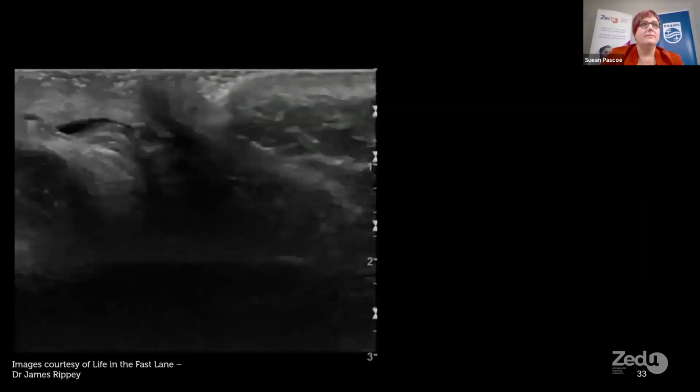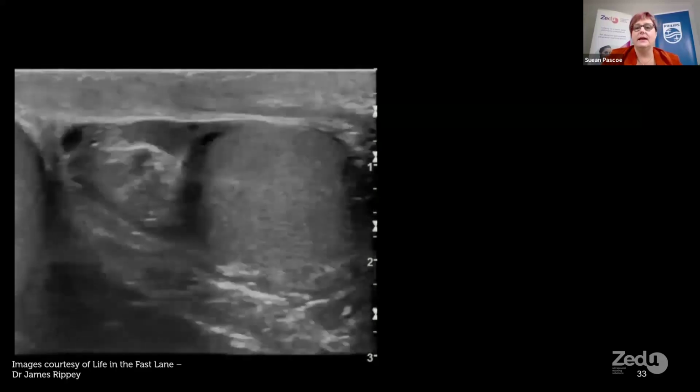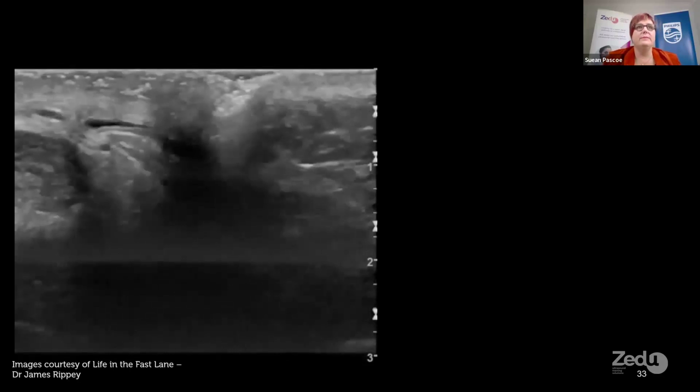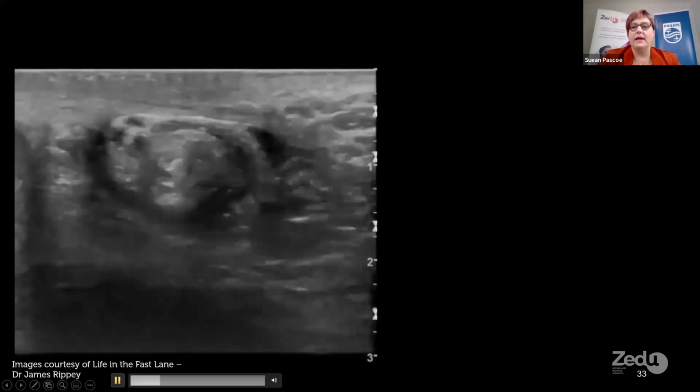Here's a case where there's testicular torsion with preserved flow, and you can see on this video loop here that there's evidence of a twisted cord or a whirlpool sign. So as the probe sweeps inferiorly over the cord to the testis, it's seen twisting through 360 degrees. And as we come back in the sweep, you can see that twist again. I'll just play that again.